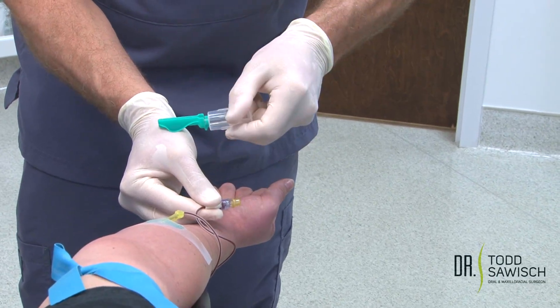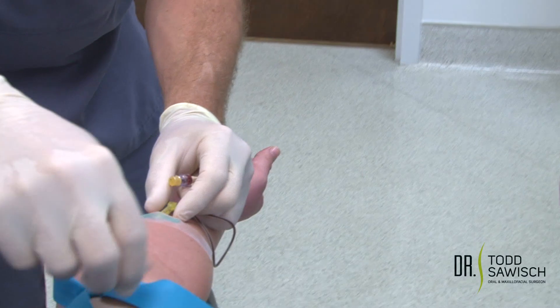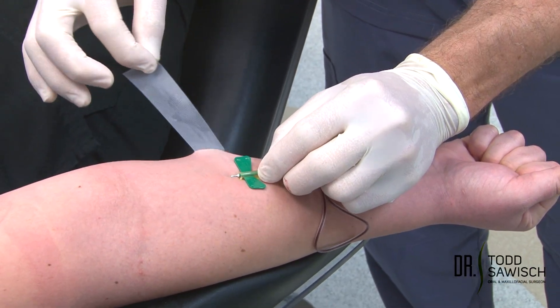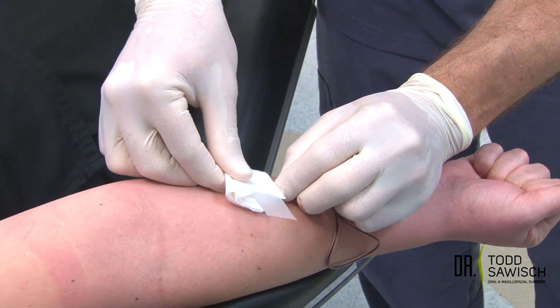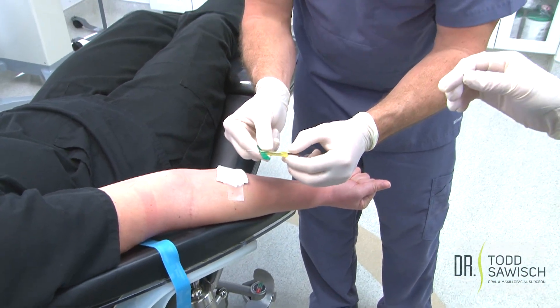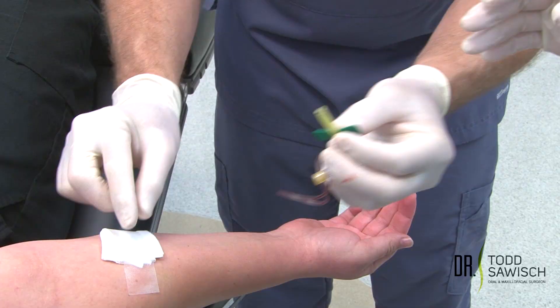I have a sharp — secure for safety reasons. I'm going to go ahead and lift up, take off the tourniquet first, then lift up the tape. I like to support this as I lift the tape so it doesn't puncture anything else. We're going to take gauze, put pressure, pull this out, and put tape here. This has a protective mechanism — if you slide this yellow piece up, it protects the needle. For safety purposes, this is then discarded in a sharps container.